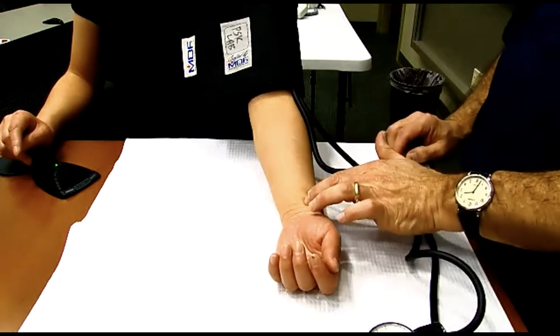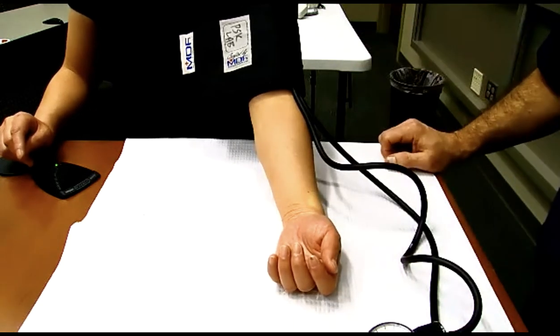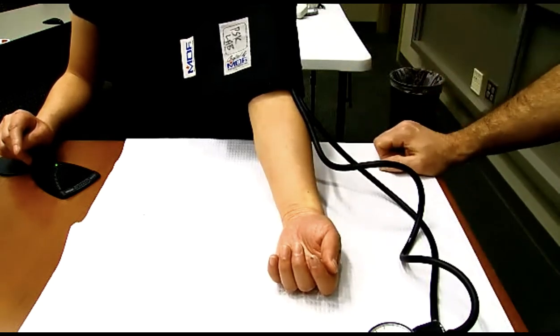Or calculated right there, but you're going to want to take the pulse, write the number down, and be able to tell the patient later. Okay, so we have taken the pulse. That was step number four. Step number five is now to estimate the systolic.